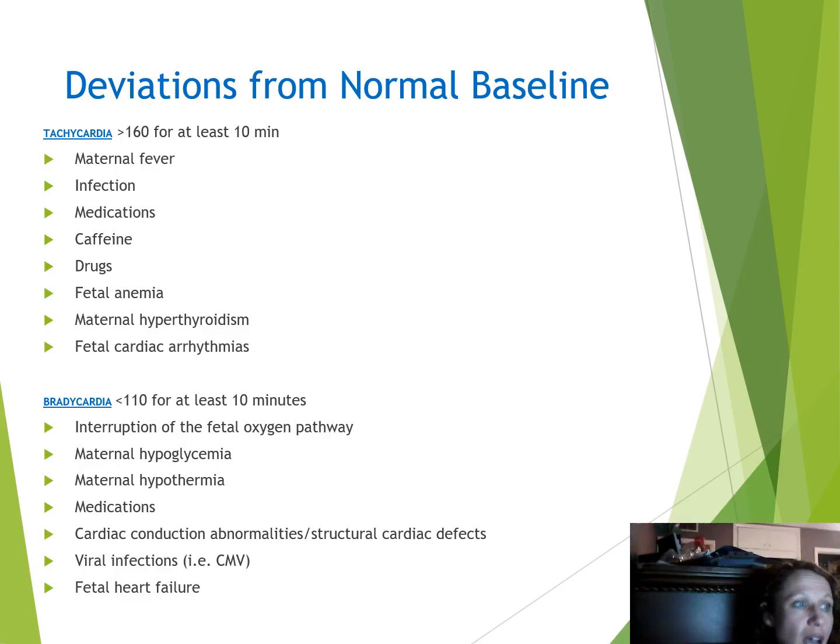For bradycardia, again, these are both if they last longer than 10 minutes. The interruption of the fetal oxygen pathway is one of our first things that we're thinking about, especially if it's significant bradycardia. But really, we're trying to figure out the cause. That's always the best thing. We want to know the cause so that we can actually treat it.